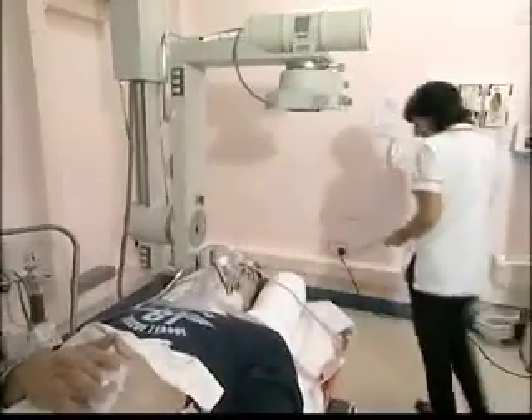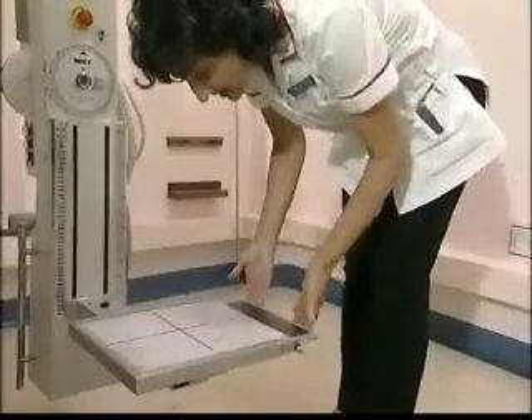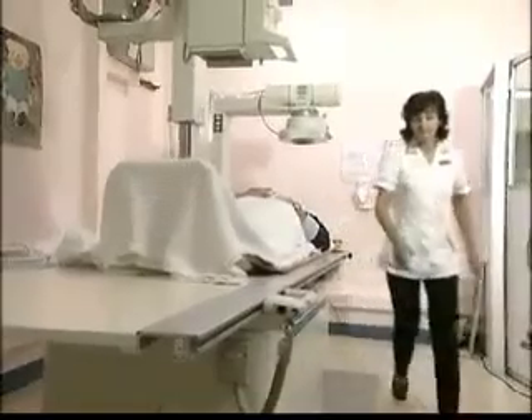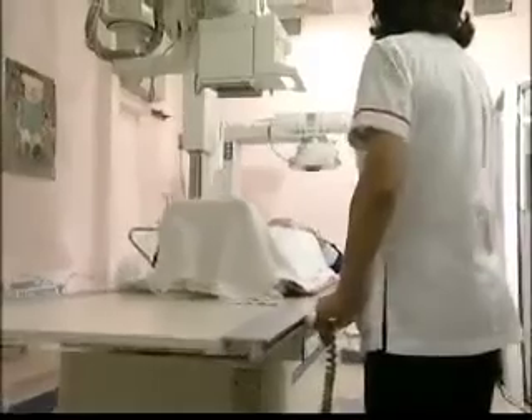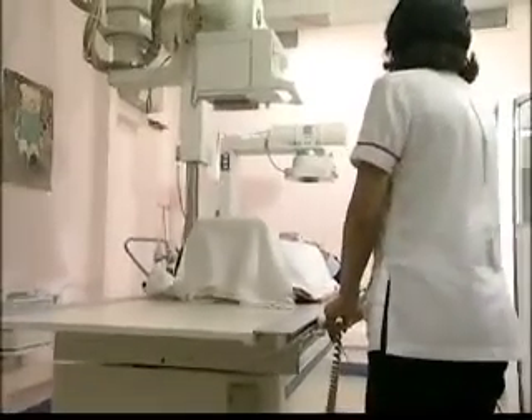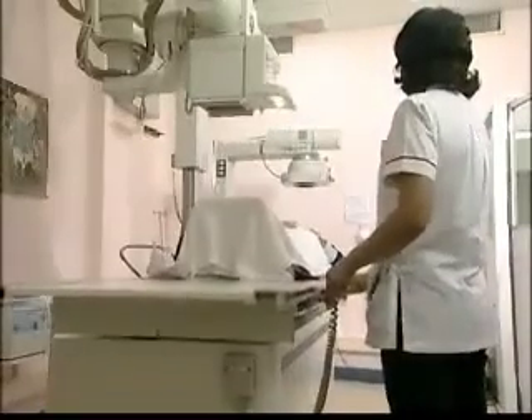The radiographer inserts a cassette to record the X-ray image. In this case it's not a traditional screen film cassette but an array of phosphors. These store luminance as a function of X-ray exposure and act as a glow memory of the X-ray intensity at each point.